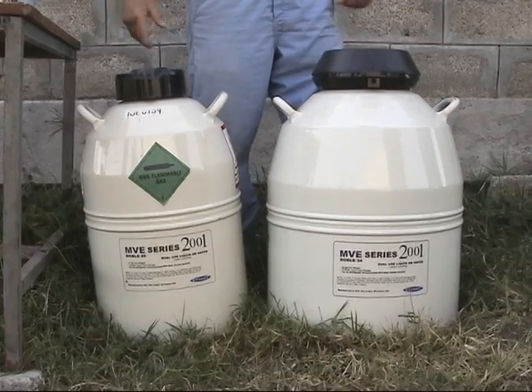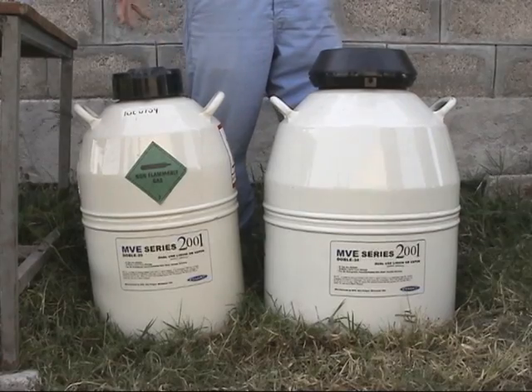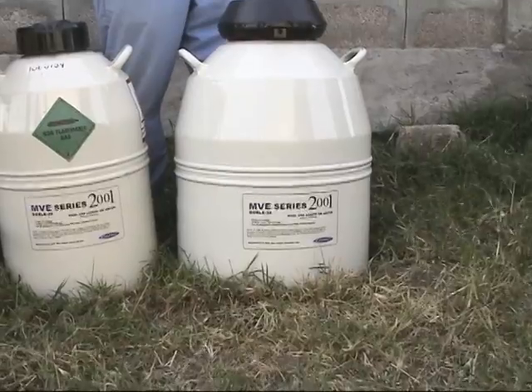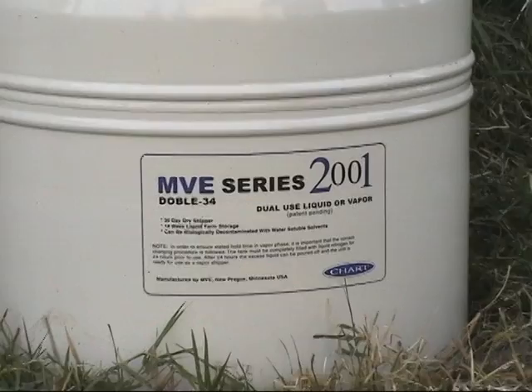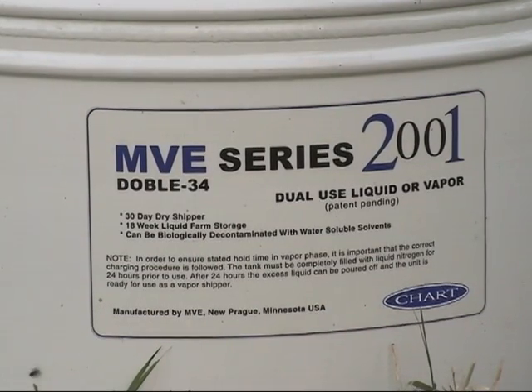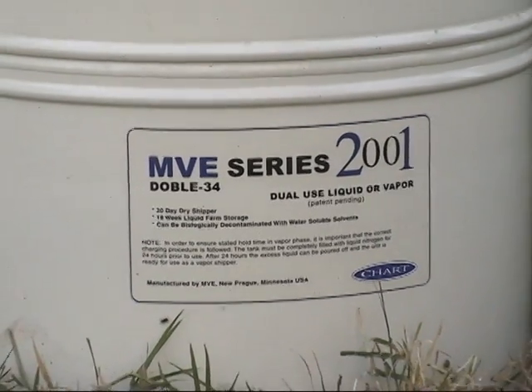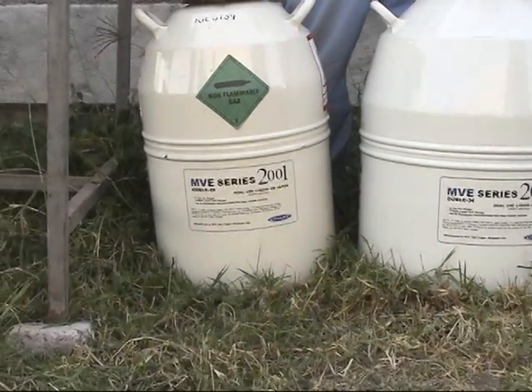There are various manufacturers of these tanks and they come in different capacities. By capacity we mean two things: the length of time the tank will keep your product frozen, and the number of straws that each tank can hold at maximum fill. Usually there is a trade-off — if you have a longer storage time between fills, you have less space inside and can keep fewer straws.